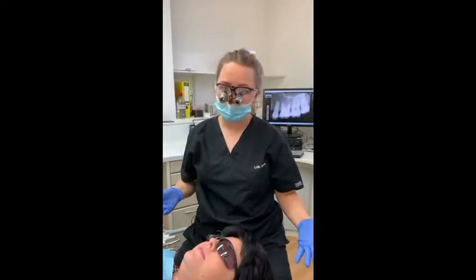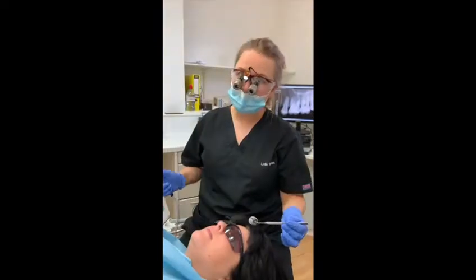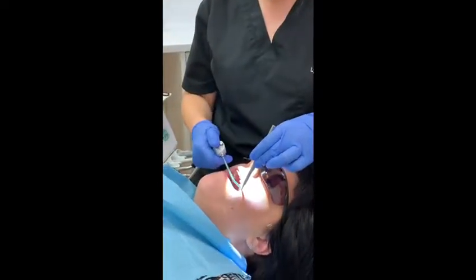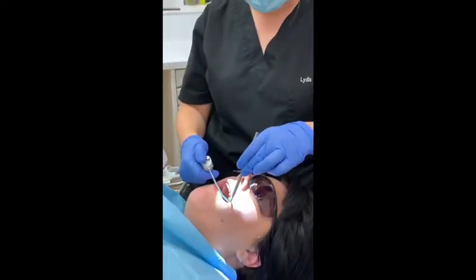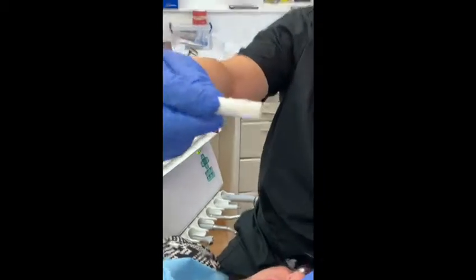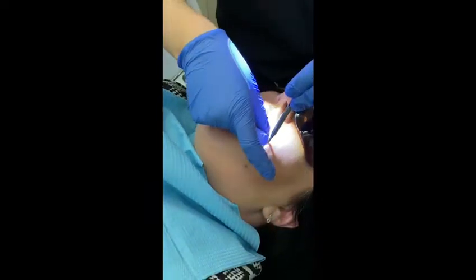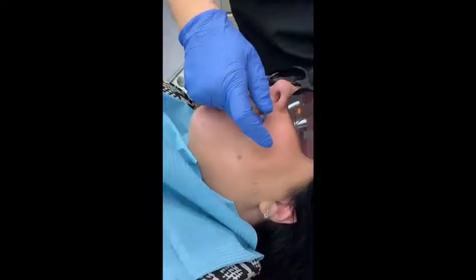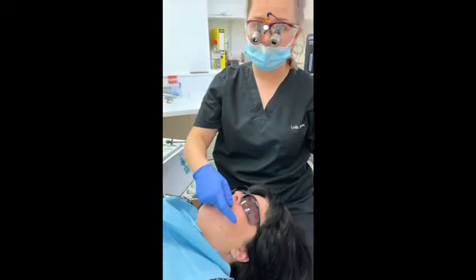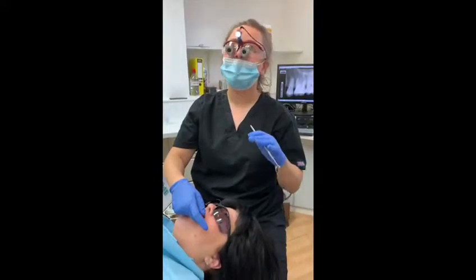So today we're going to show you how we do an anaesthetic here at Bespoke Smile. When we numb a patient up for any kind of treatment or procedure, we first put some numbing gel on the gum. So this is a topical anaesthetic — it's just some gel on the end of a cotton wool roll — and all I'm going to do is place this on the gum next to the tooth where we're placing the anaesthetic, and then leave it here for a minute or so. What this does is numb the surface of the gum before we put the anaesthetic in, making administration of the local anaesthetic really comfortable.